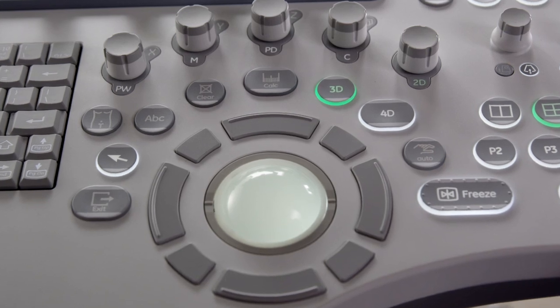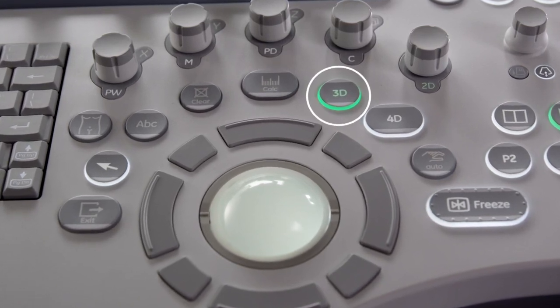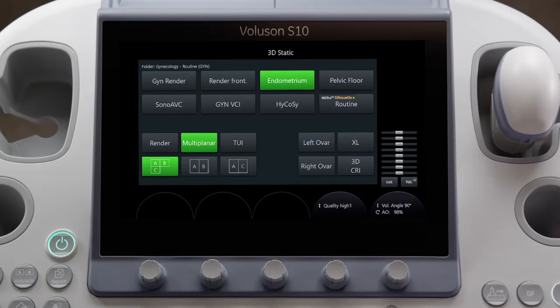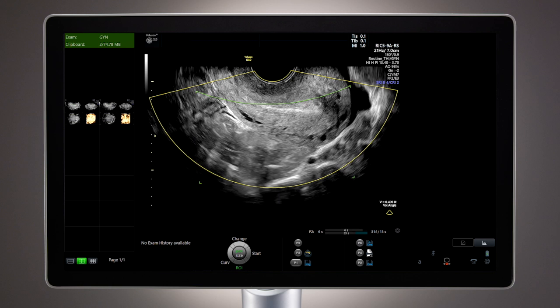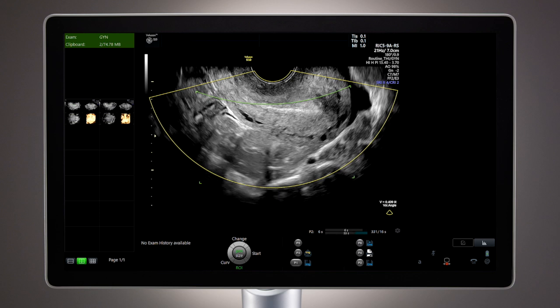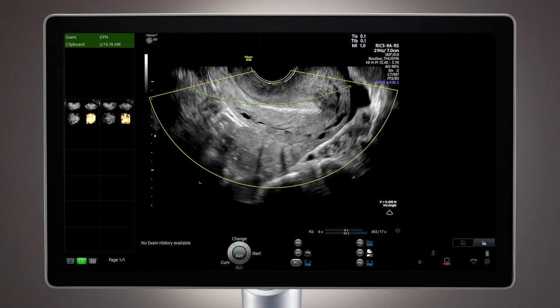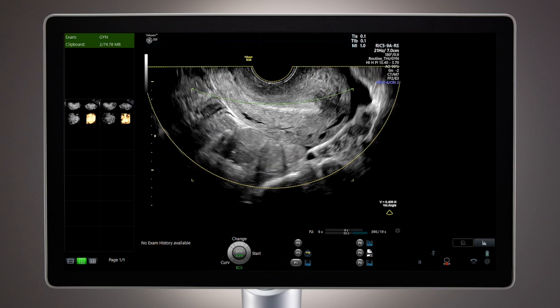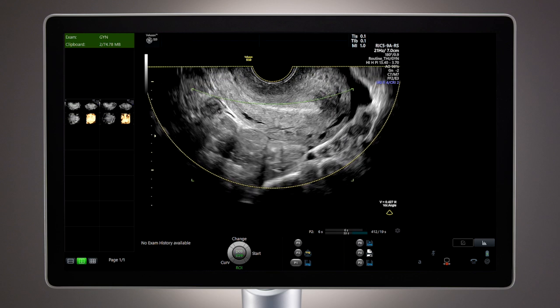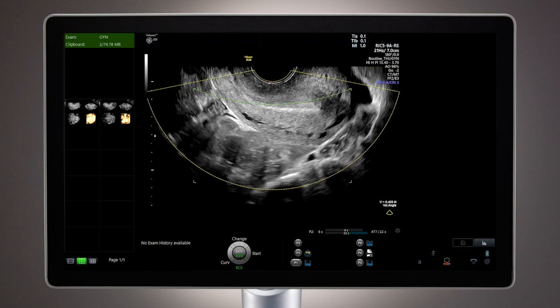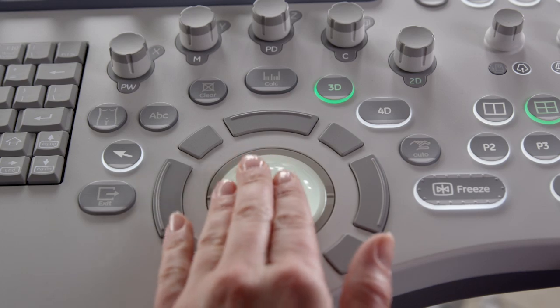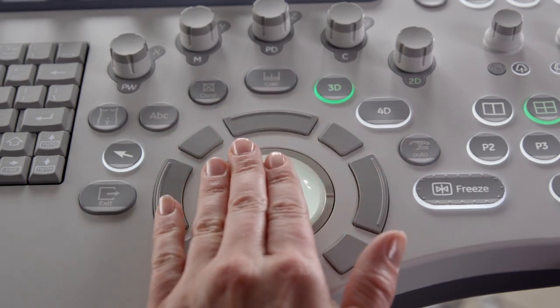To start the acquisition, select the 3D hard key. 3D has its own set of presets, so when preparing to acquire a volume, select an appropriate 3D preset. A yellow region of interest or ROI box will appear on the monitor that you will place over the area that you want to acquire as a volume. The position and size of this box can be adjusted using the trackball and set keys.